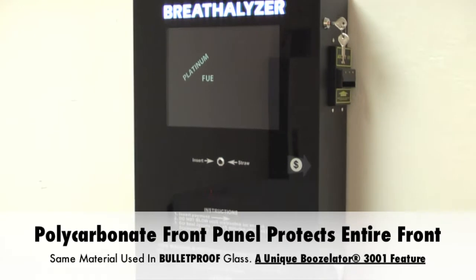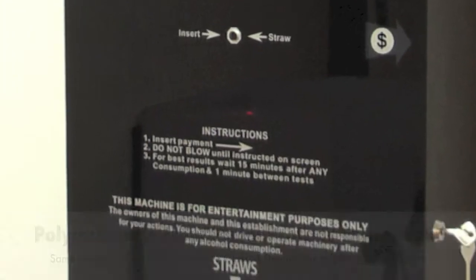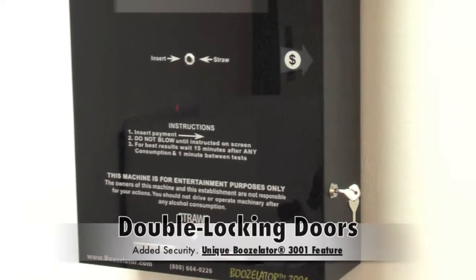On the front of the machine, there are instructions for usage to walk the user through the breathalyzer process. There is also a disclaimer on the front of the Boozellator to relieve both you and the bar owner from liability.